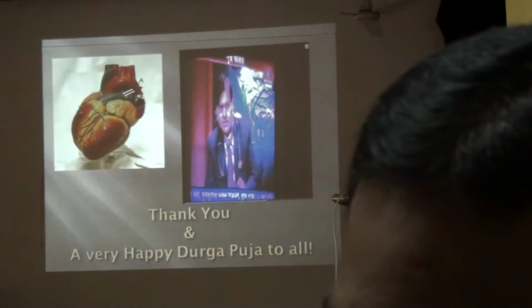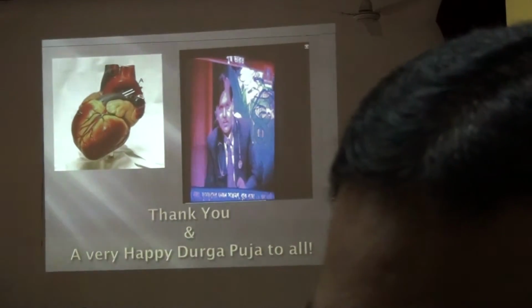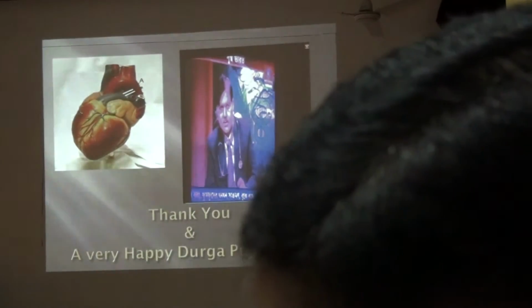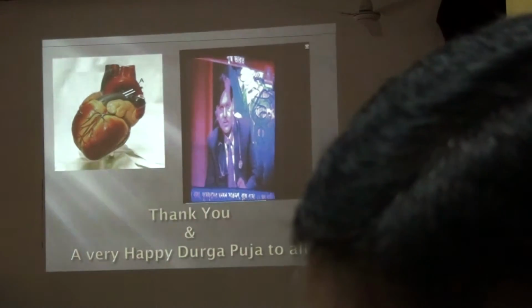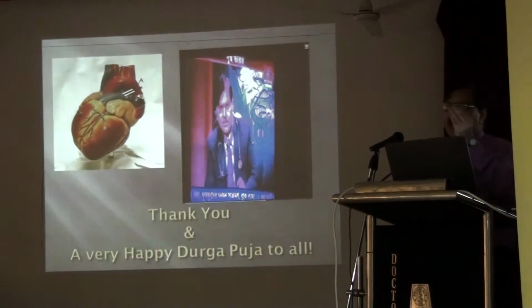But a clot is mostly near the valves or the apex. Ideally both shape and size can be the same; these are the similarities. But myxoma will mostly be pedunculated, attached to the atrial margin, and its movement will be free. The clot will be over the valves, and it will generally be hyperechoic. That way you have to do the differential diagnosis, and we can rule it out. Similarly, third is vegetation. Vegetations will be small, over the surface, either on the valves, tips of the valves or near the valves, and many times on transthoracic echo we can even miss them.